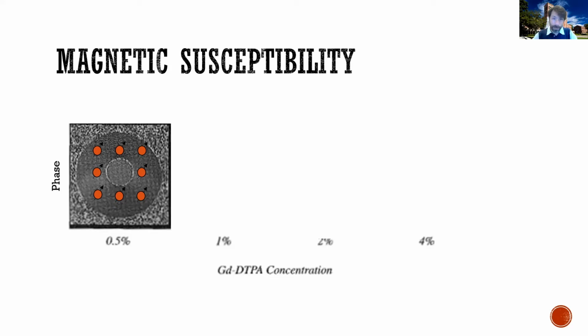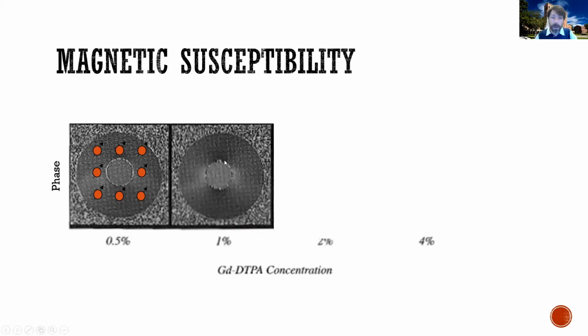So now let's do the following experiment. What we're going to do is take the same setup, but inside the blood vessel, we're going to inject 1% gadolinium. Now, gadolinium is a compound that is also paramagnetic, much the same as deoxyhemoglobin. So if you put gadolinium inside a magnetic field, it will distort the magnetic field. And you can kind of see that, because see this little white shaded area right here, and in fact, right here. And it's tough to see, but there's a little darker shaded area right here and right here.